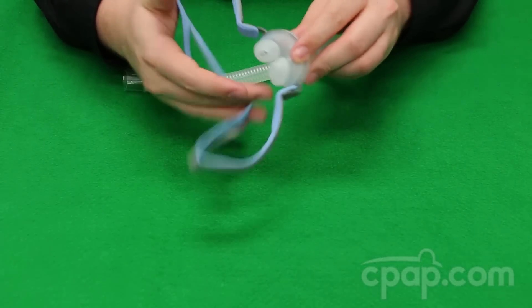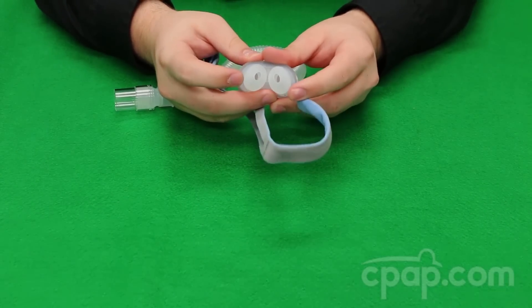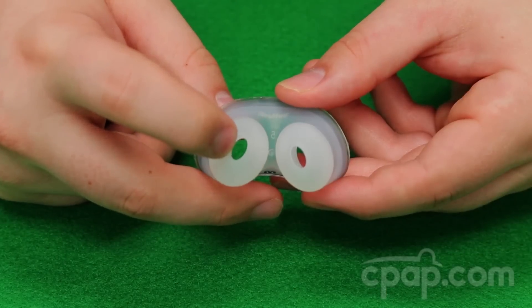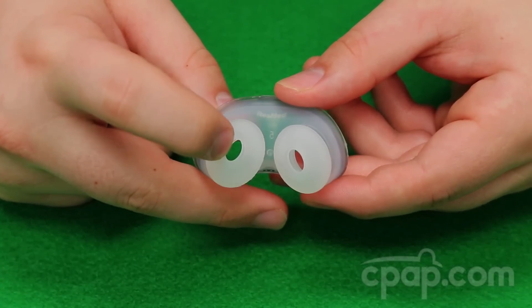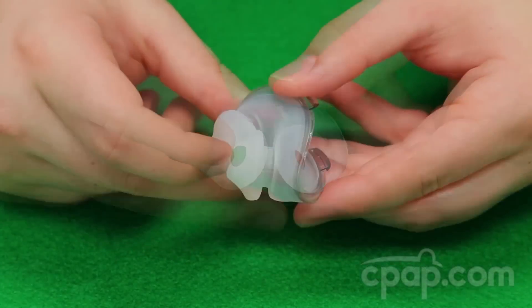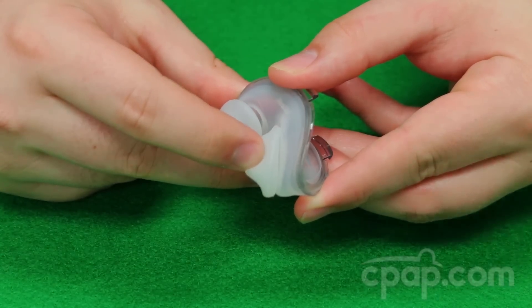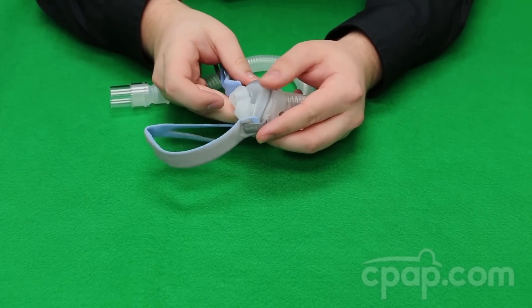The AirFit P10 nasal pillows are designed to adapt to changes during sleep. They are dual wall pillows which add extra support to maintain a proper seal. These pillows also have a trampoline action where the nasal pillow stem can compress, allowing the pillows to move with the user when sleeping positions change.